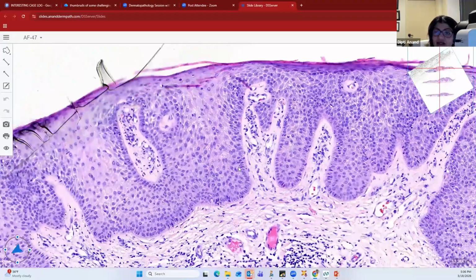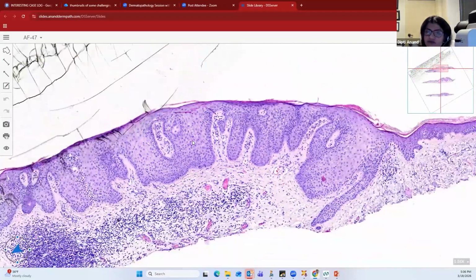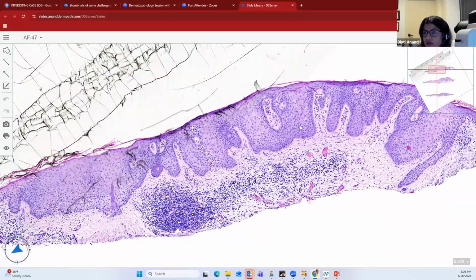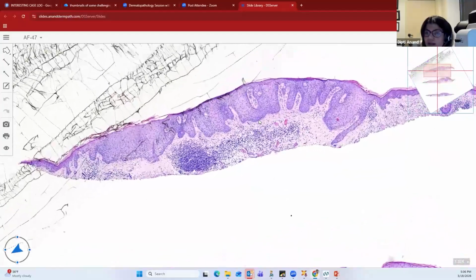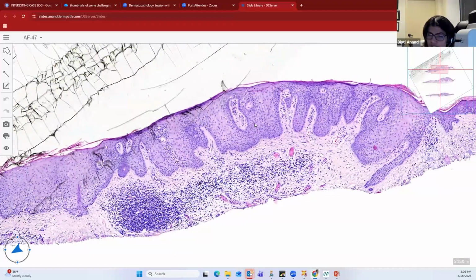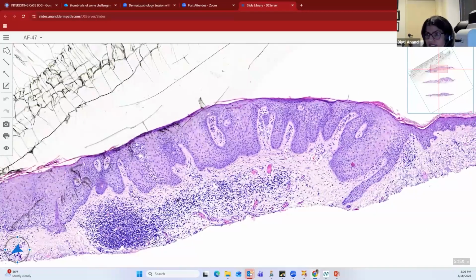So they have an outer palisade and the inner cells which are cleared up with distinct cytoplasmic borders. So the nature of the clear cells is different, and also the architecture is important, because a pale cell acanthoma looks like a plaque of psoriasis because of the nice suprapapillary thinning and the dilated vessels, which will be absent in a trichilemmoma. So whenever they show you a clear cell trichilemmoma, they will often compare it with the pale cell acanthoma. So you should know the difference.